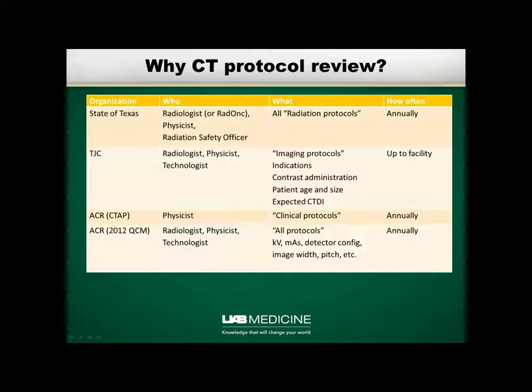I should say one of the SAM's questions does involve what the ACR requires for protocol review. Well, what they require is what's in the accreditation program. To the best of my knowledge, what's in the quality control manual are only recommendations. If you follow those recommendations, you're very likely to fulfill the requirements. But again, those are recommendations.